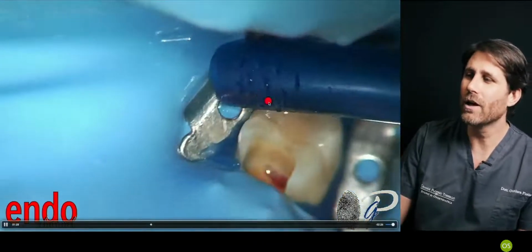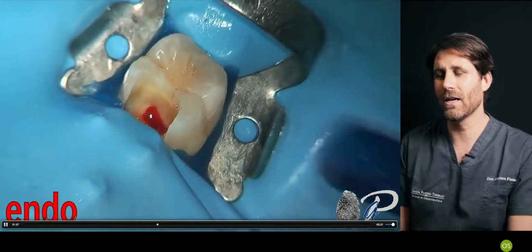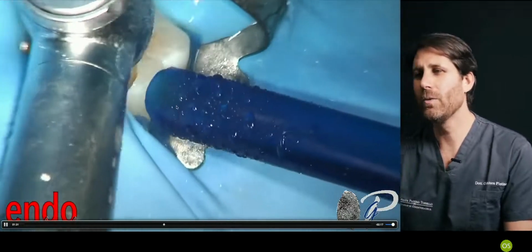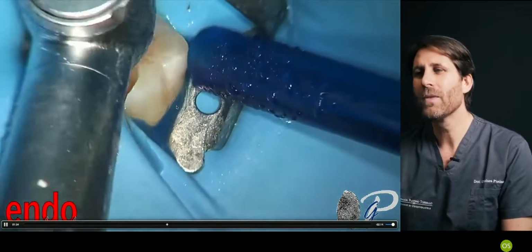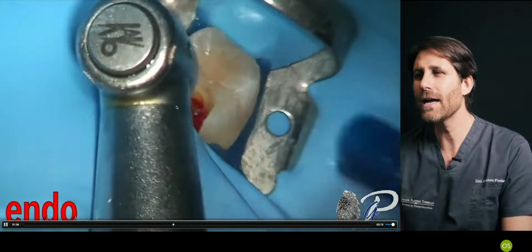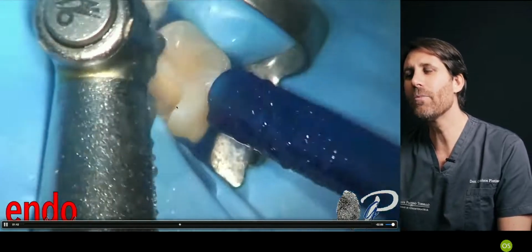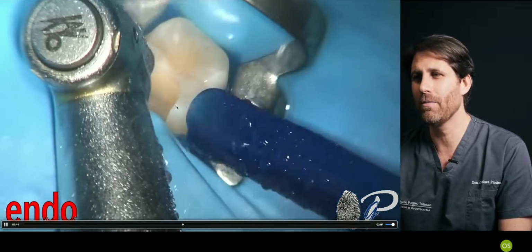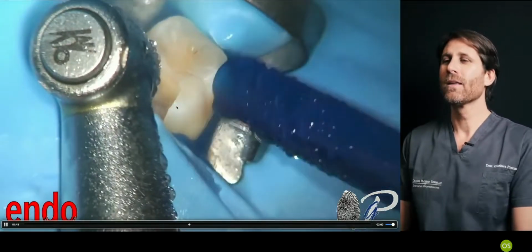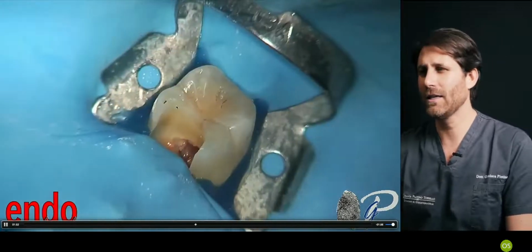And just look, we have an orifice-directed orientation of the distal canal. So as soon as we are there and we can go inside with a small instrument, we start appreciating the anatomy of the root canal. In this case, I only use a round multi-blade carbide burr just to remove the carious tissue before entering the pulp. I don't like to use round burrs, and we will see. I use them only to remove the caries, not going inside the pulp chamber.